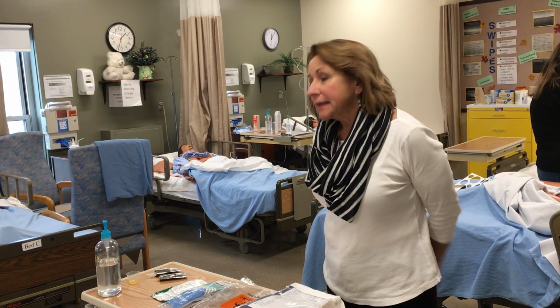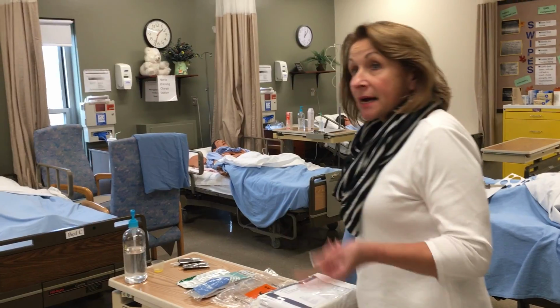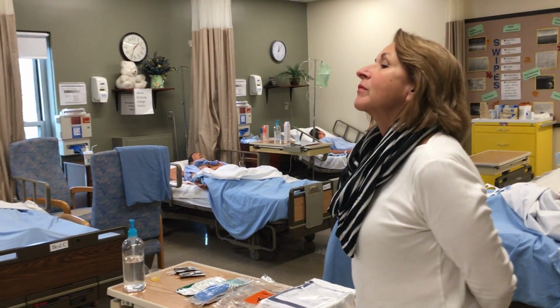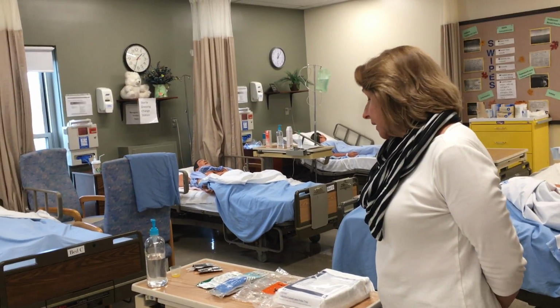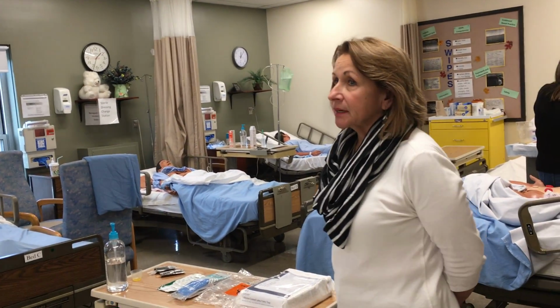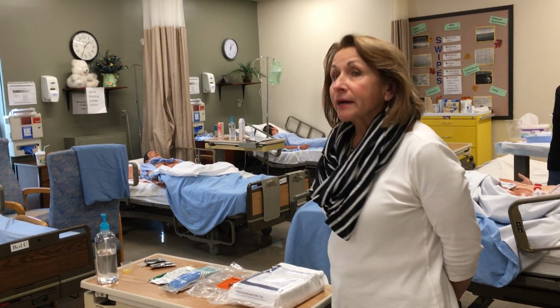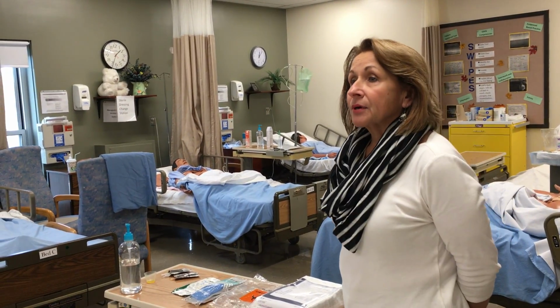Today the skill we're focusing on is urinary catheterizations. Two types of catheterizations. What are they? Intermittent and indwelling. Okay, good. Straight, intermittent, or indwelling. We called them Foley catheters for a long time, but now it's more typically called Foley insertion.